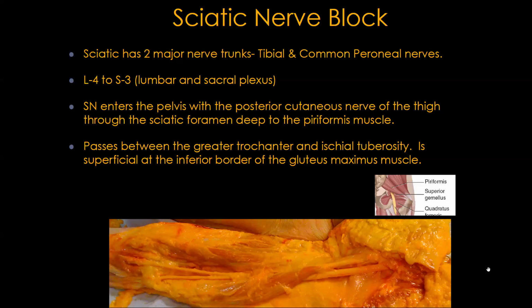The paraneurium is a sheath outside the epineurium that allows the nerve to slide inside when you're bending your knee or moving, so it glides and prevents the inability to glide. So down here, this is your posterior tibial and your common peroneal, and you see this connection between the 2 nerves there. That is the paraneurium, and I'm going to talk about popliteal and how you really have to be in the paraneurium in order to get a good block.